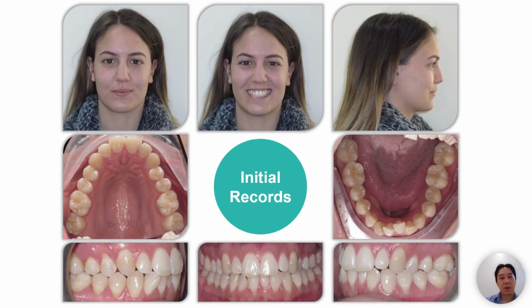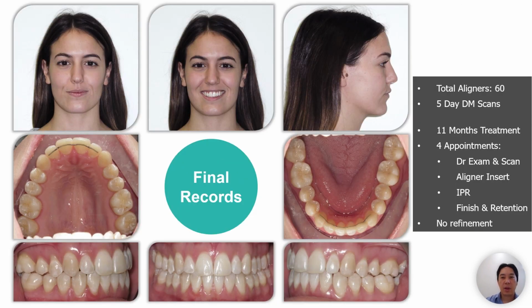Okay, so we're going to have a look at a case here. It's not the world's hardest case. It's a reasonably straightforward case, but I think it really illustrates the strength and the power of dental monitoring. So you can see class 1, mild to moderate crowding. And so that's her final records.